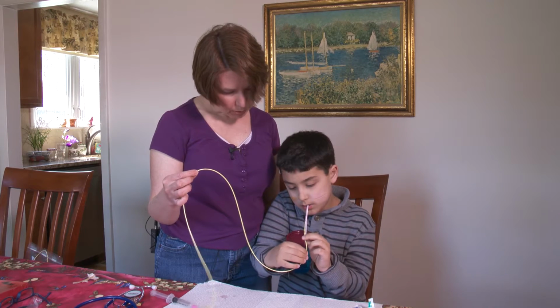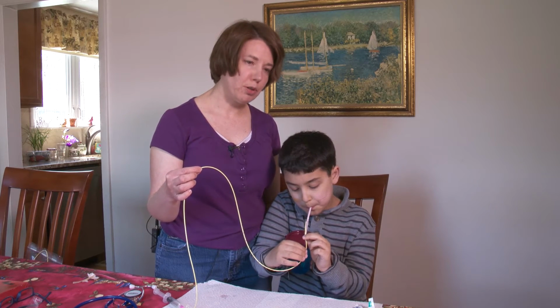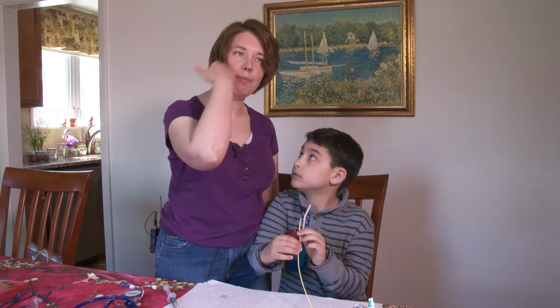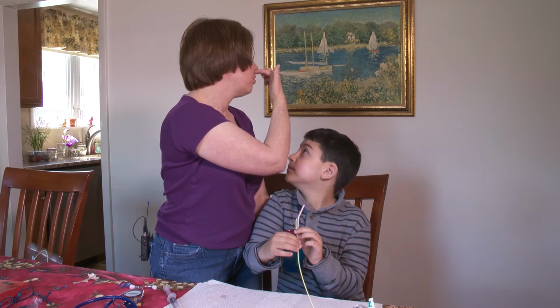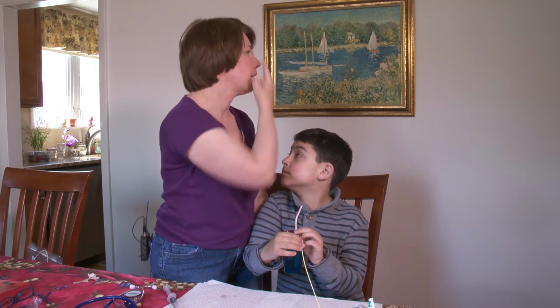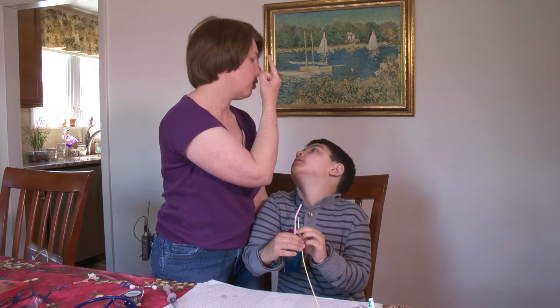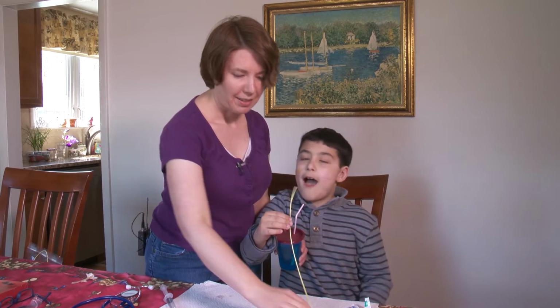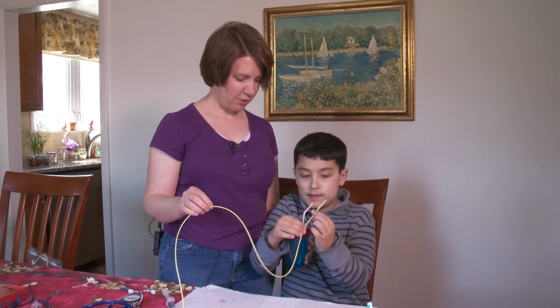Now, remember, you're not putting the tube up your nose. You're putting it in your nose. So you're going straight back, like aim for your ear. If you're putting the tube in, you're aiming back this way. If you aim up your nose, you'll just tickle your nose and you won't get it anywhere, right? And that happened to me a couple times. Right, so he needs to be reminded.